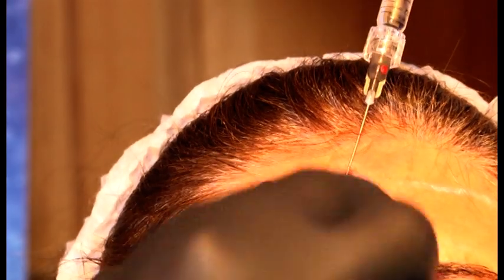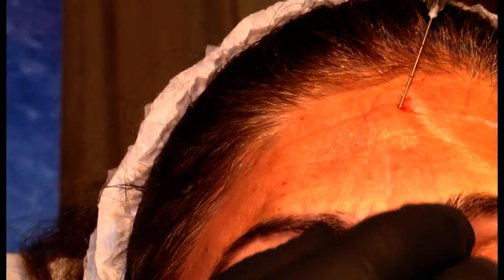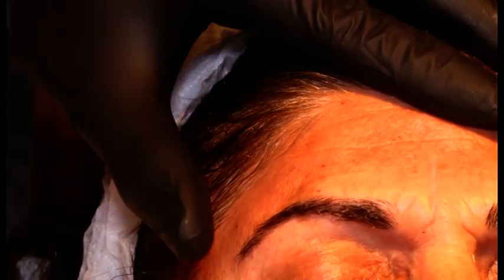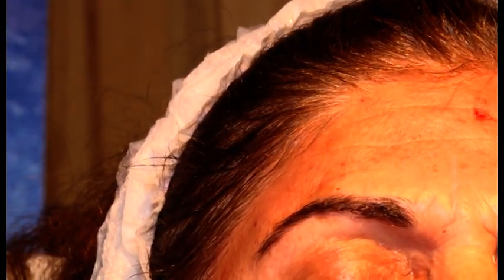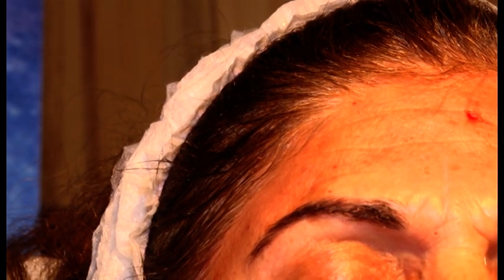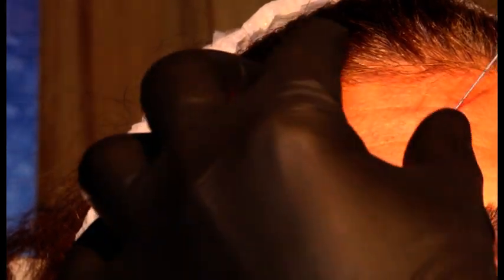Now, normally, I would walk to the other side, but actually you walk to the other side, Ovid. What? You want me to walk? Actually, you know what? I'll come and inject from that side, because I'm injecting with my left hand now. It's okay. All right.